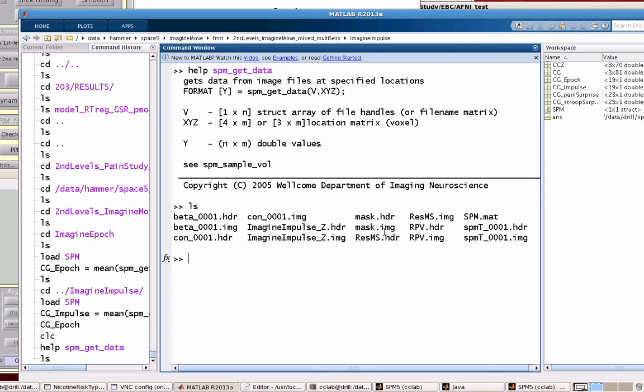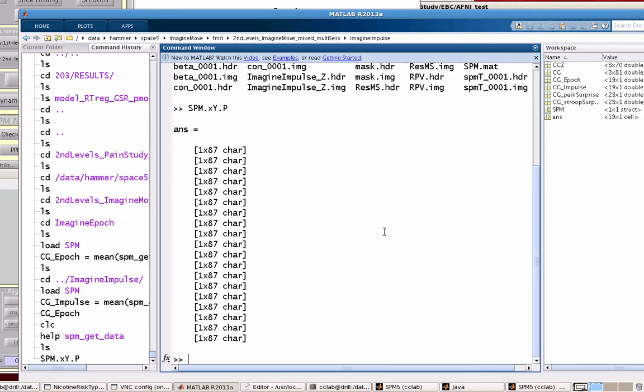So how do we get this V structure that contains information for each of these contrasts? If you go into a results directory, say we ran a second level analysis, you'll have an SPM.mat file. If we go into the second level, it will have a field available in SPM.xY.P that tells you what the path is to each of these contrasts that you might be interested in.